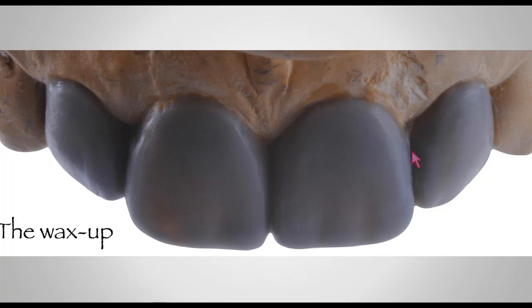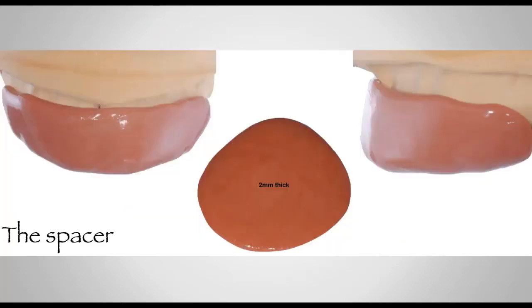So right now I can say with high confidence that the amount of tooth structure that I need to prepare for this case is minimal. And that's another purpose of the actual bonded aesthetic prototype, that it helps you as a guide.